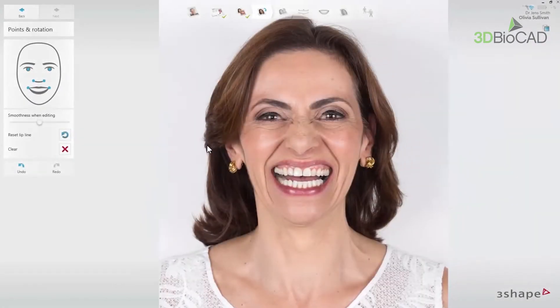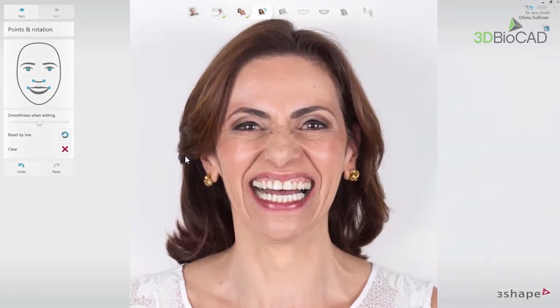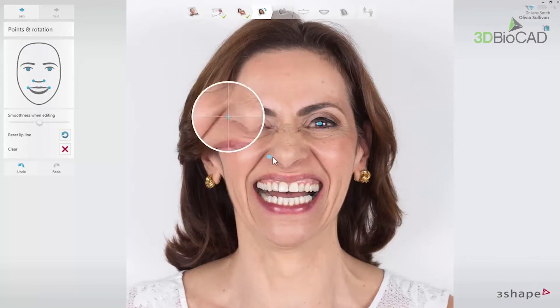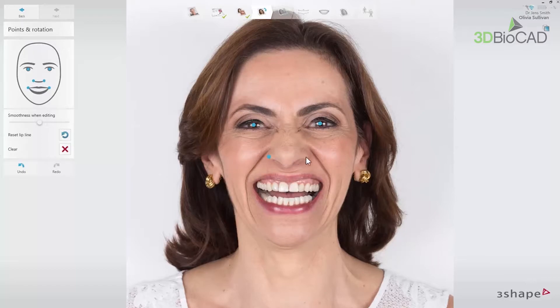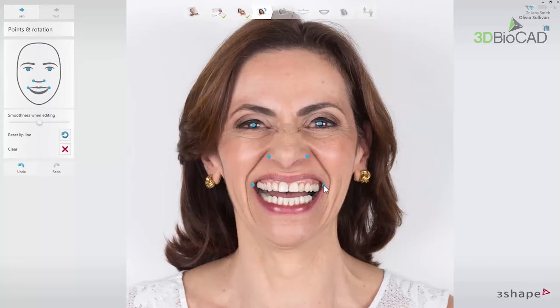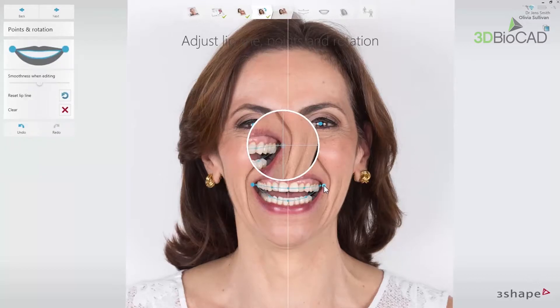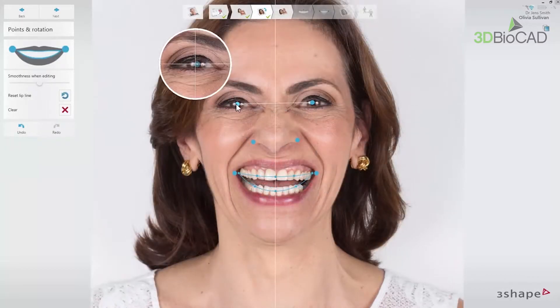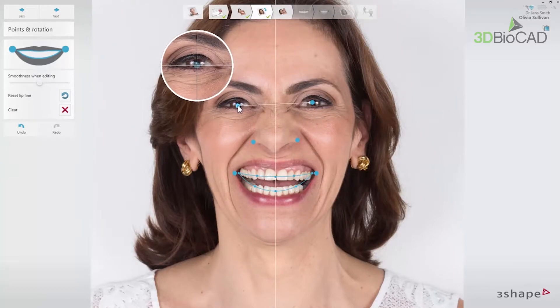In this step you should perform the alignment of the photo to find the balance of the face by placing three sets of reference points. Put the points on the pupils, nasal wings, and commissures. You can do that in any order. The magnifier glass tool can help with the precise placement of the reference points and can be disabled if necessary.